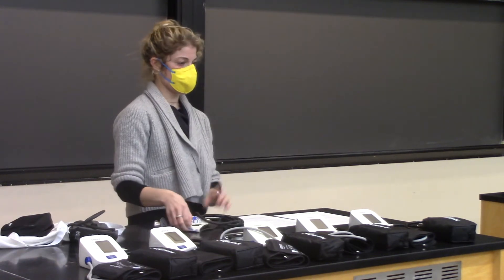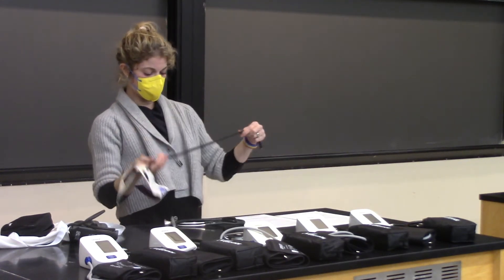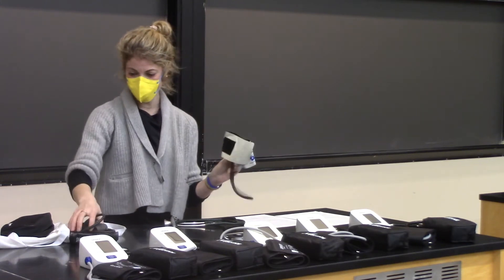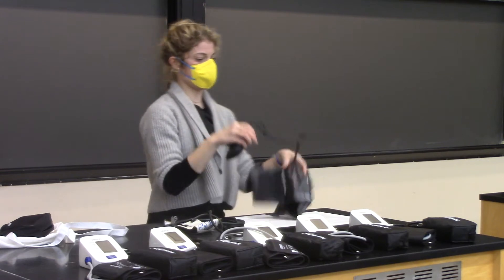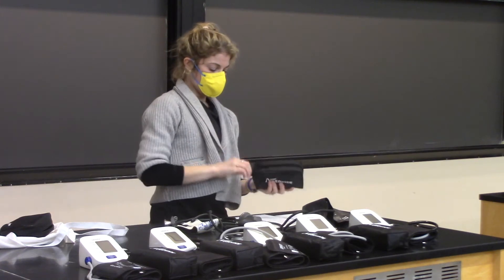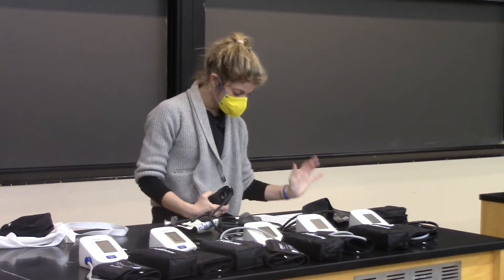We probably don't have the pediatric cuffs here. My old blood pressure kit has a pediatric cuff, which you don't need. If you ever do, this is what it looks like — small. And here's the big cuff. I've given you a handout, which is kind of like a one-page cheat sheet.